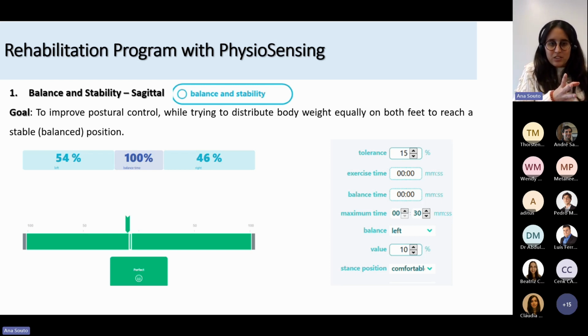So now this is the target area of the exercise, and we can progressively move the target towards the center. This can be a progression. Because if we do it in the real center, the patient will not be able to validate the dot and it will always be red, and it's not good to motivate people.